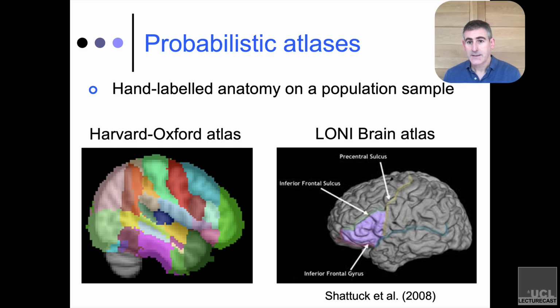In many cases, although that's sort of painful and you might not want that level of detail, that is precisely the information that's going to start to allow you to do this manual recognition of the anatomy. Because if you know what the borders are and start to get good at recognizing those borders, say in your individuals or in a group, then you're no longer reliant on these automated tools. You have the basic knowledge necessary to say with some degree of accuracy, this activation's in this particular anatomical region.